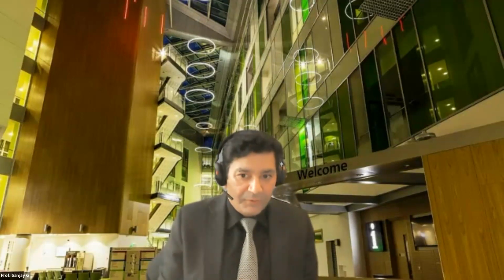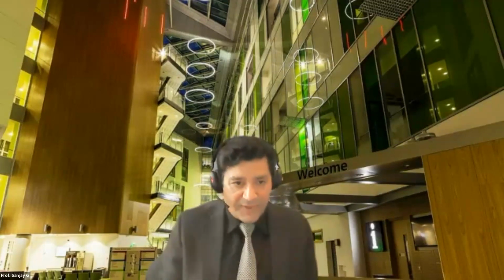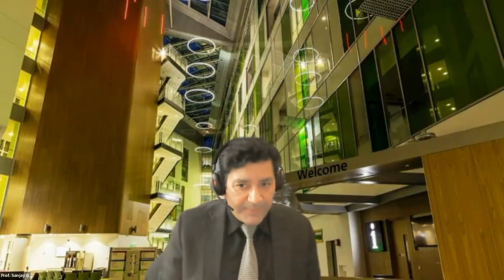Saurabh Rothgi to talk to us about imaging in myelopathy, because my understanding is, as previous speakers have mentioned, it helps in confirming the diagnosis, determining the causes, and monitoring the progress. But I look forward to hearing from Dr.